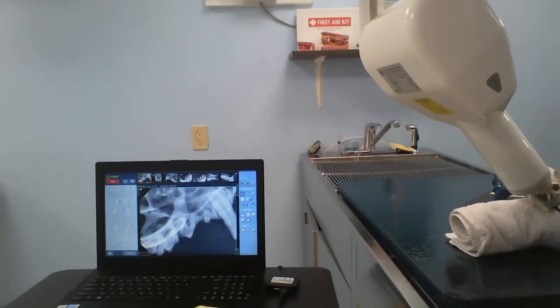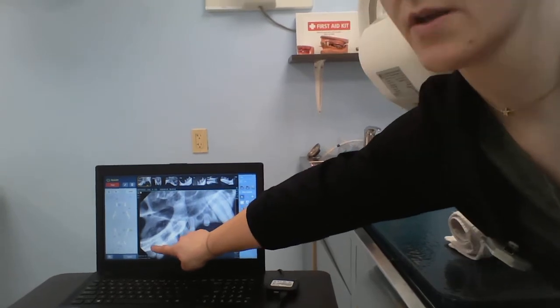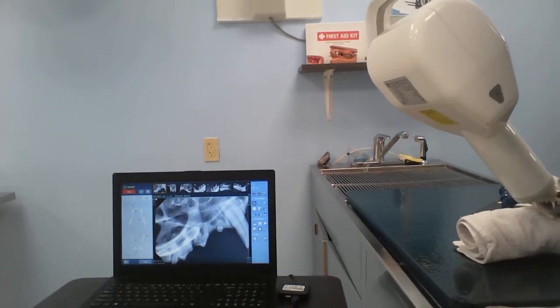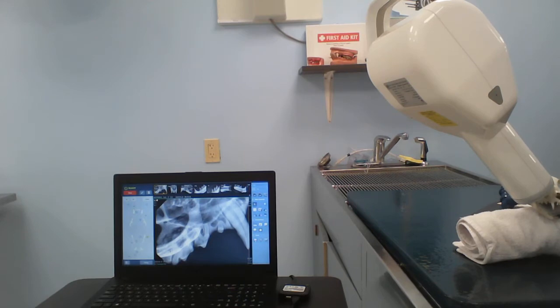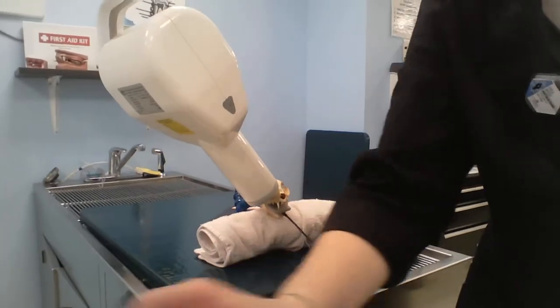So you can see over here, we have the upper right. You have the canine all the way back to the molars. And then you can see that this big white thing here is the zygomatic arch. That is in the way. It's over top of the molars and premolars in the roots, but you can see them through that. I'll do a separate video on evaluating the dental x-rays a little bit better, but you can still see them. I will show you at the very end of these videos a different way to x-ray the upper quadrants, just to move that arch on the back side.